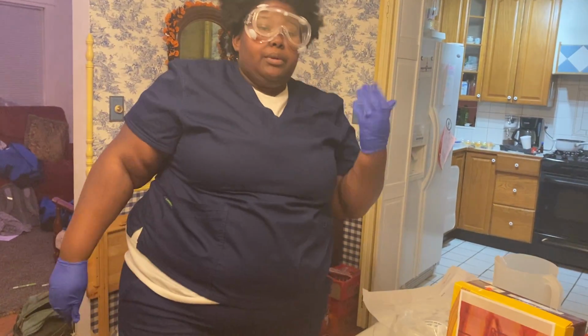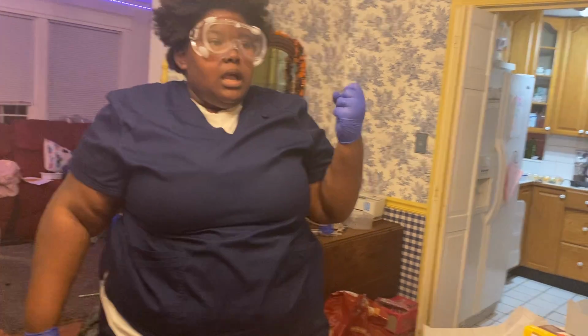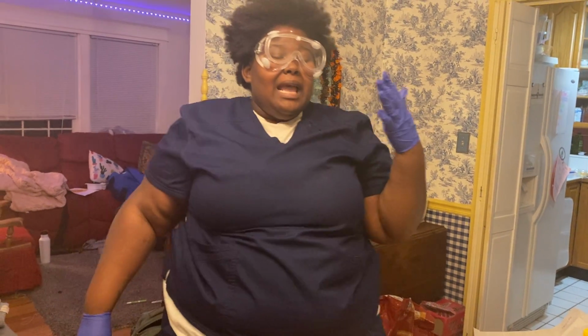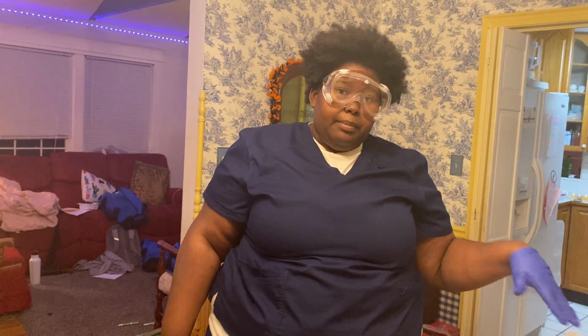When I pull that out, I will document any color, odor, consistency. Then I'll perform daily peri-care or daily catheter care, and document how many times it was performed on the patient, and any things like that.